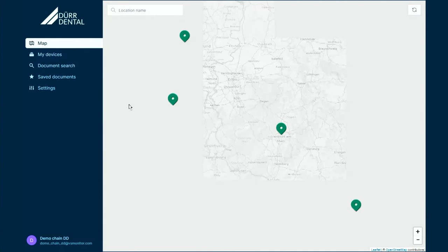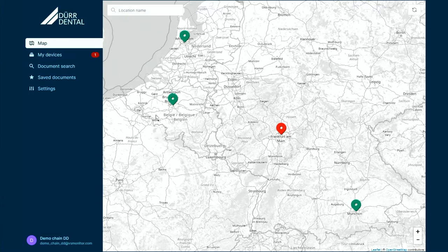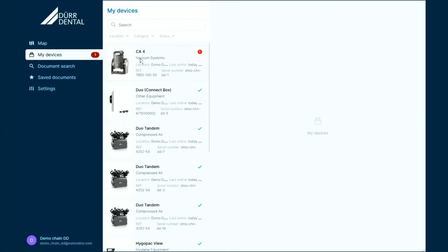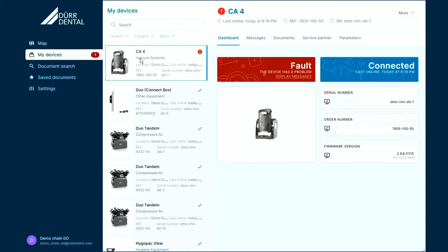In this case, we have an example of a practice network with several locations. If one of those devices in a location has a notification or a warning, it is shown in this user interface and you can see it in the list of your devices. It's highlighted here, and you also get notifications on your PC and via email.